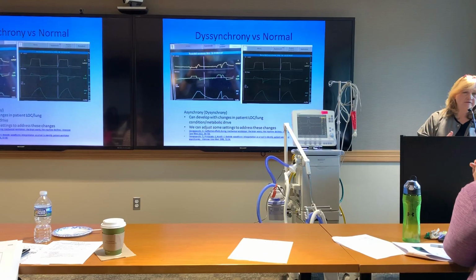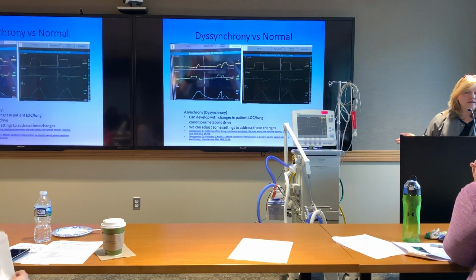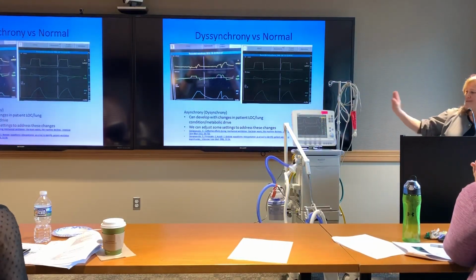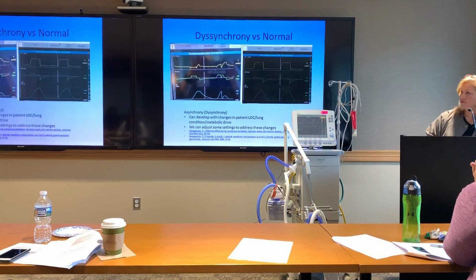But dysynchrony is a real big issue, actually, for patients. It totally prolongs their length of stay on the ventilator, which prolongs their length of stay in the ICU. It actually affects overall outcomes. There's a couple good studies there that you guys can refer to if you feel like it.